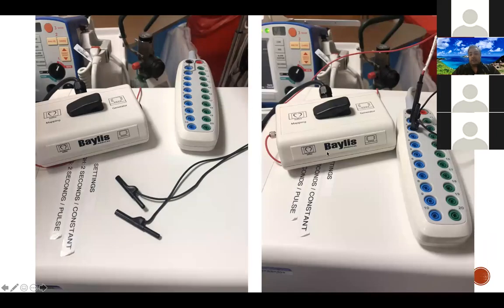The Baylis, I won't go into this much, but basically the Baylis, as many of you probably know, is set up in such a way where you can plug it into a pin box, and it allows you to visualize the tip of the Baylis on your mapping system. So you're kind of tricking the system into thinking it's a bipolar catheter when it's really just a unipolar signal. But it gives you a nice discrete icon, which I'll show you in a second, that allows you to see exactly where your transseptal needle is.